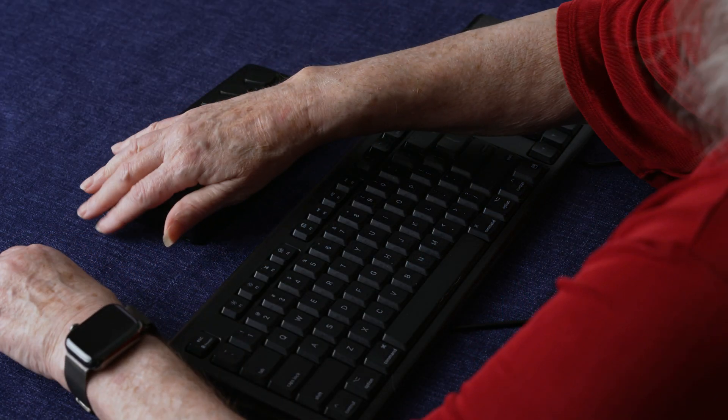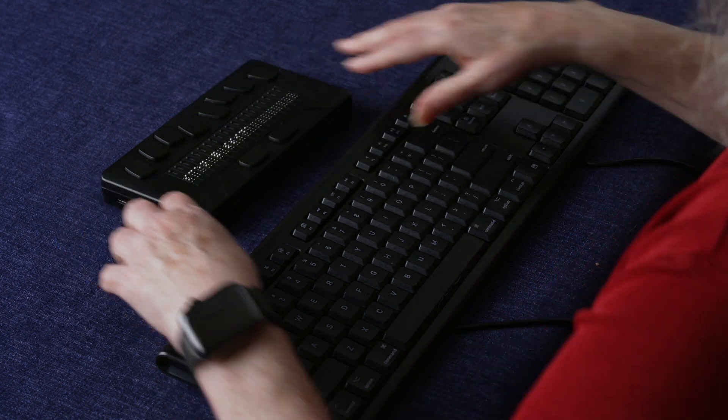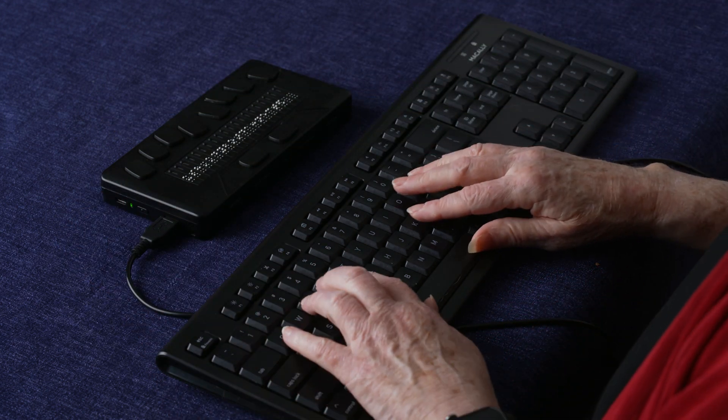To use the USB keyboard, simply connect the keyboard to the eReader's USB-A port. The USB keyboard can be used when entering text into an edit field, such as when entering a Wi-Fi password or credentials to log into an account.